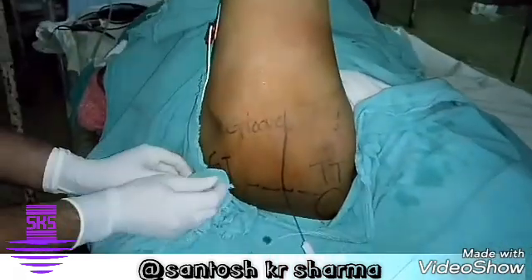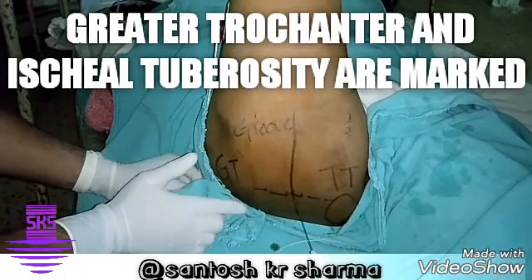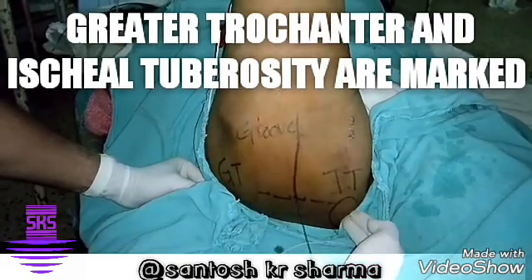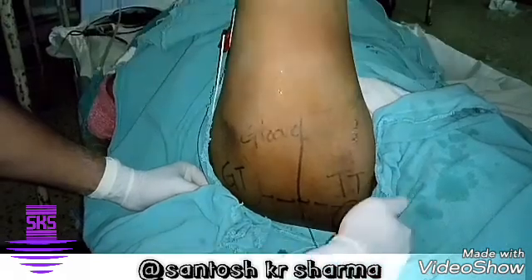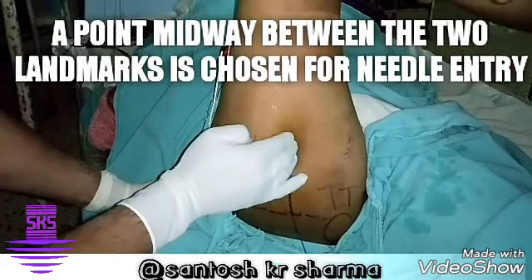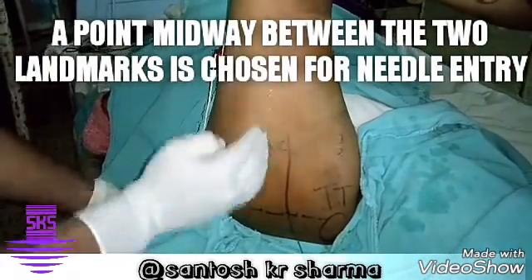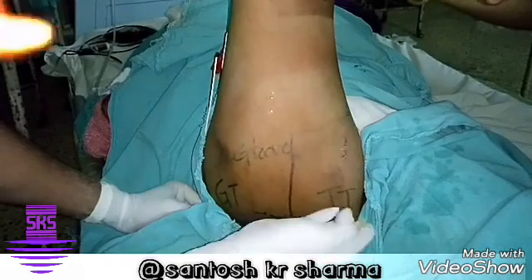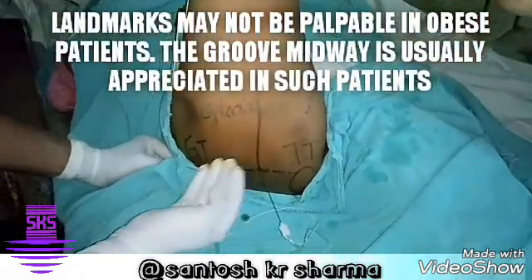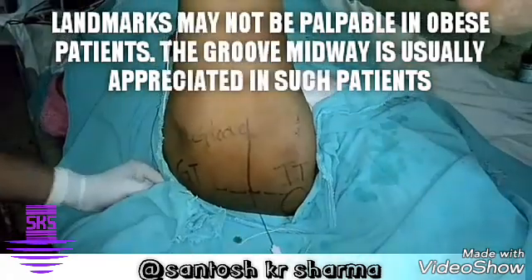This is the greater trochanter — I have felt the greater trochanter and marked the outer border. This is the ischial tuberosity, the lowermost dependent part, that has been marked and I can feel this groove. This groove extends upwards and this is the tract along the sciatic nerve. So it is basically a subgluteal or gluteal approach to the sciatic nerve in the lithotomy position.